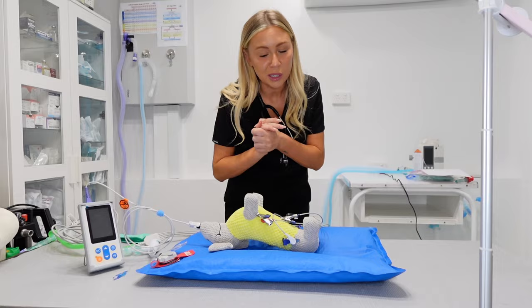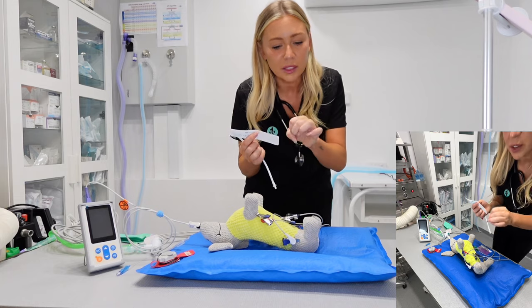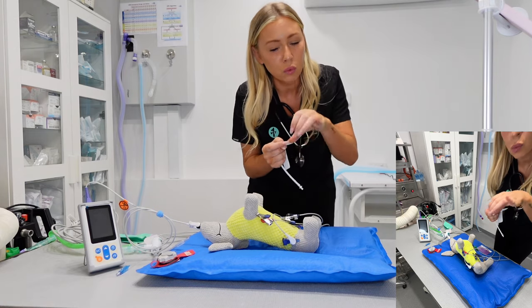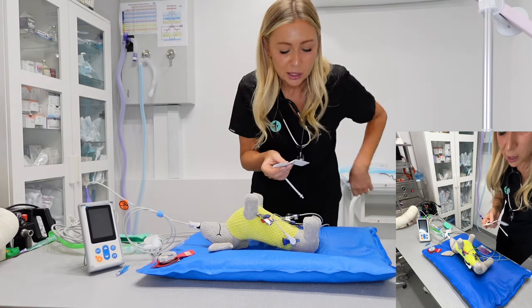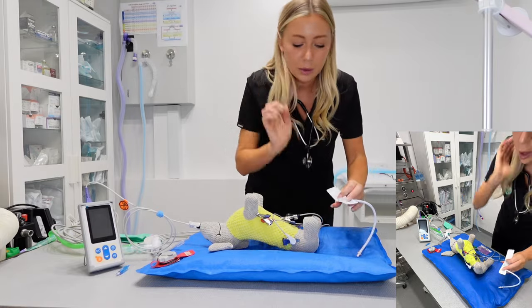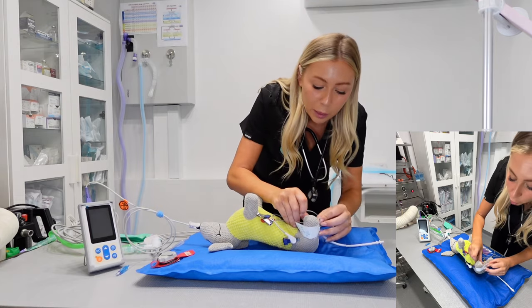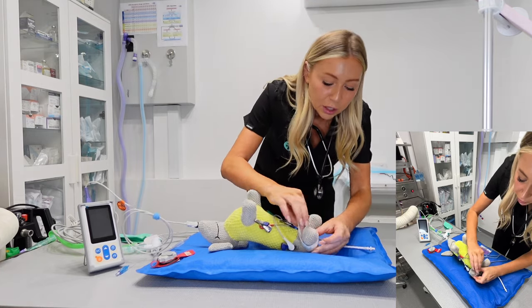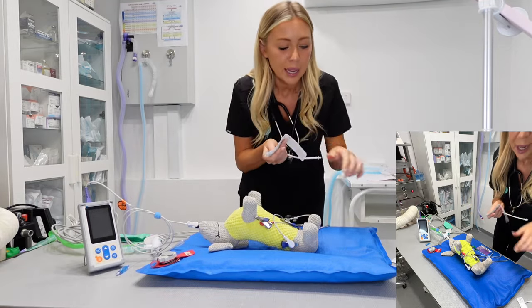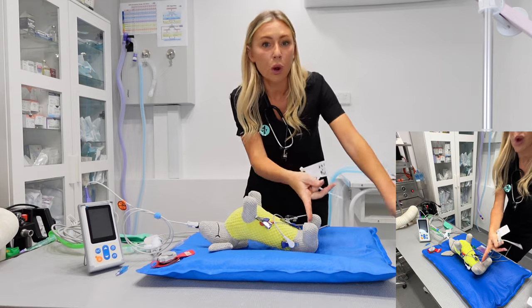Next thing I'm going to attach is my blood pressure monitor. My favourite location for blood pressure is always the tail if the patient has one — I just find it's the most consistently shaped area and always gets a really good reading. It's always the tail base, right where the tail starts. But this dog doesn't have a tail, so I'm going to use this leg here. I've semi-measured this and I should probably have gone up a size — so that was a size two and I'm going to go up to a size three, because even if it fits, when it inflates it's going to pop right off.